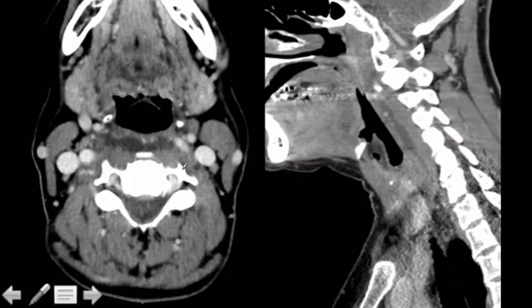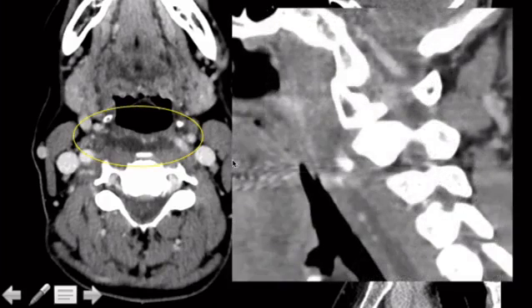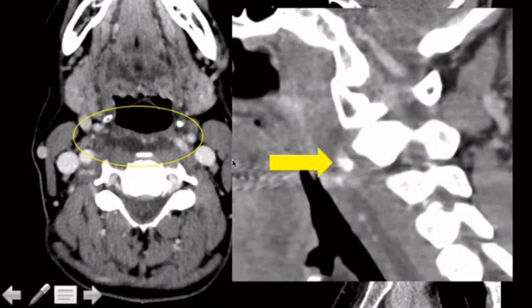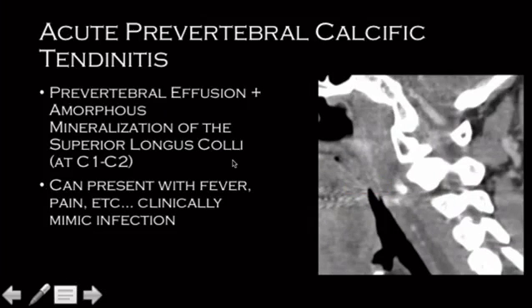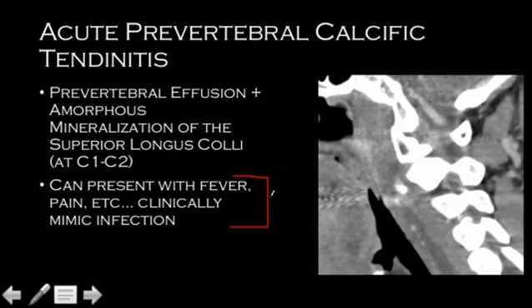Axial and sagittal views show a fluid collection. Before you call it infection, pause — and look really close in front of C1, C2 to make sure you're not seeing any amorphous mineralized density. Because if you do, you may be dealing with acute calcific tendonitis. That's the location you see it at — it's hydroxyapatite, and it can cause an acute inflammatory process that mimics infection. It's pretty much always at that location, right at the superior longus colli.